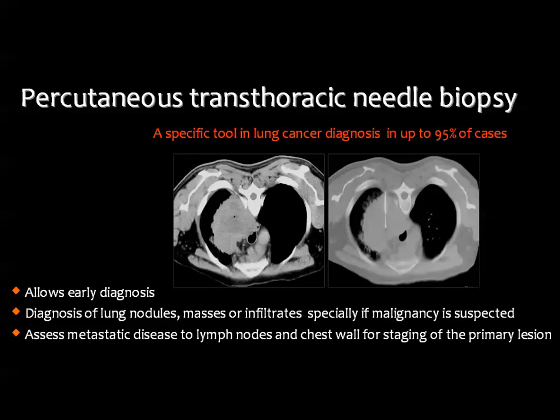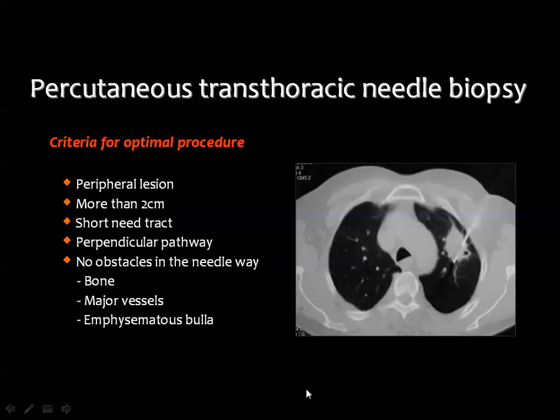As you know, the diagnosis of bronchogenic carcinoma many times is easy, but you should have a biopsy even whenever you are 100% sure that this is bronchogenic carcinoma, in order to confirm the diagnosis first and to know the cell type of the tumor, as I have mentioned before. Then CT-guided needle biopsy is a simple maneuver. It requires some skills to be performed accurately without doing harm to the patient himself.